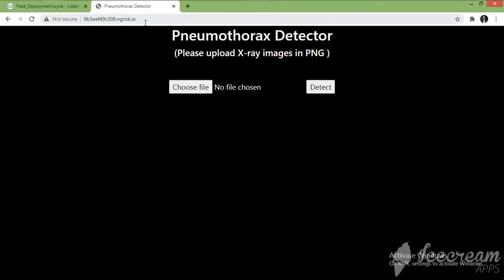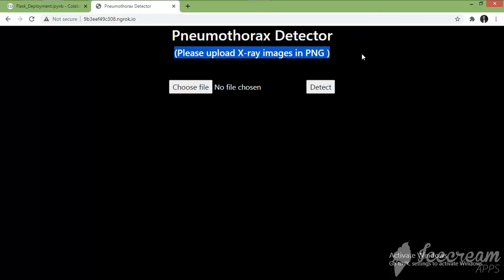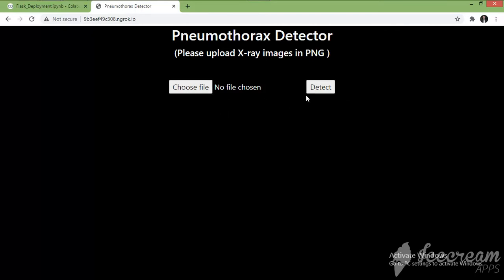When we open this page we can see some text and two buttons. 'Choose File' is for uploading the image or X-ray, and 'Detect' is for predicting whether the disease is present or not.